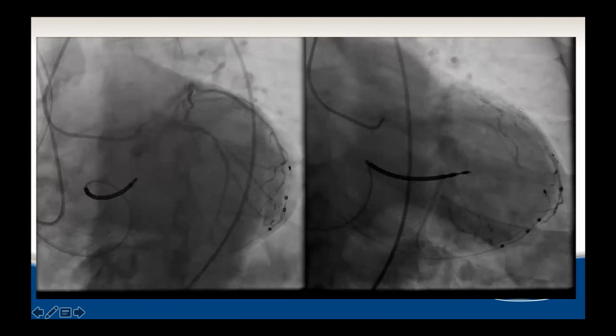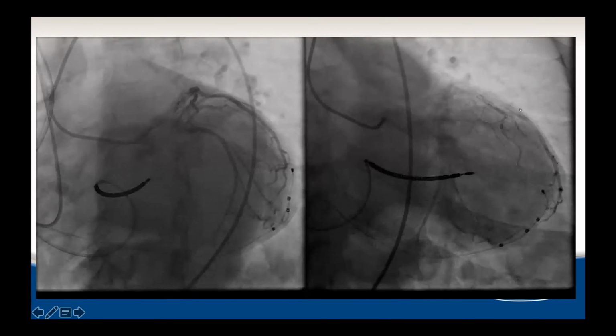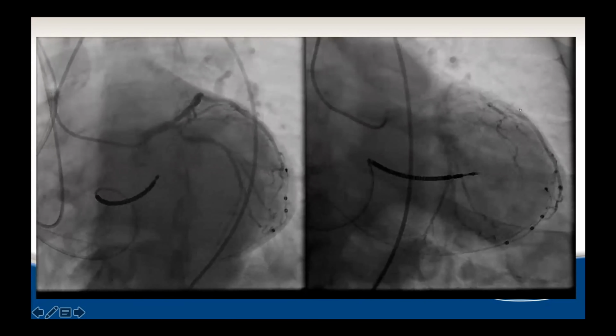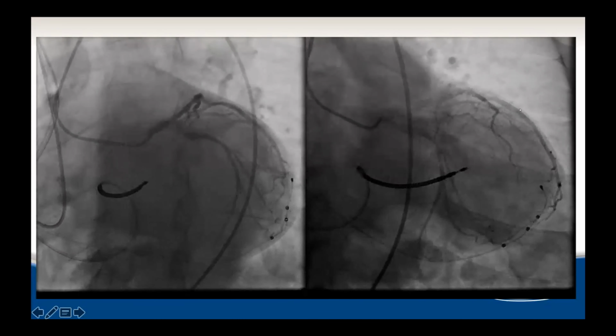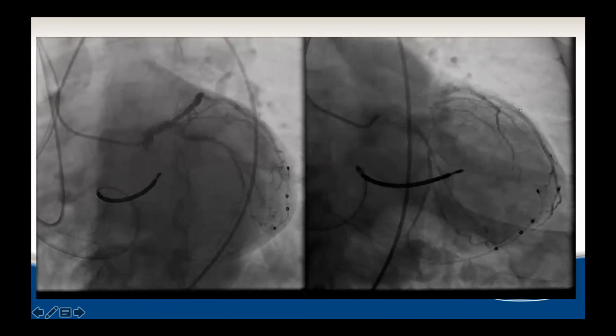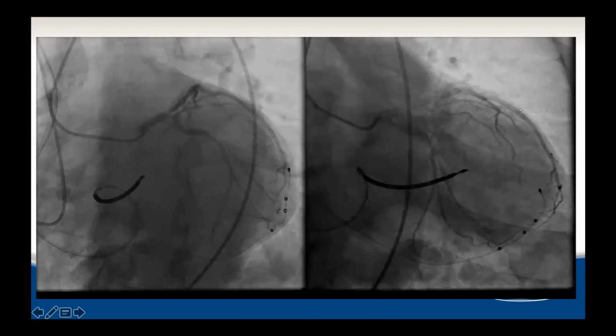So with these, it's a little ambiguous, and we're looking at it here. It looks calcified enough to me that I would not be at all surprised if you needed atherectomy for the proximal portion of the LAD. How to do that is dealer's choice in our lab. A lot of times that would be a mid-sized burr, and see if that gets you enough to fracture the calcium. The angles into the circumflex are always a piece of it.